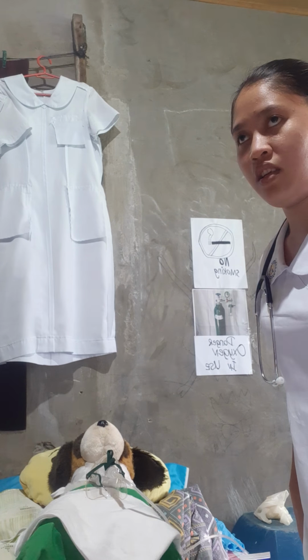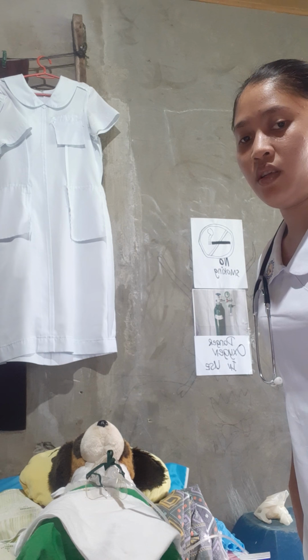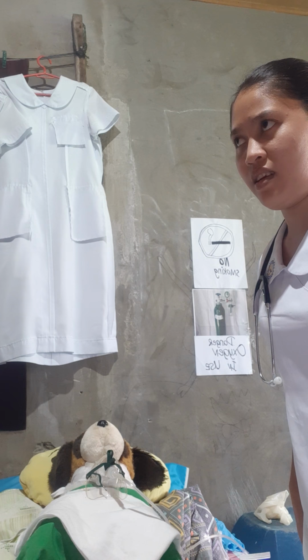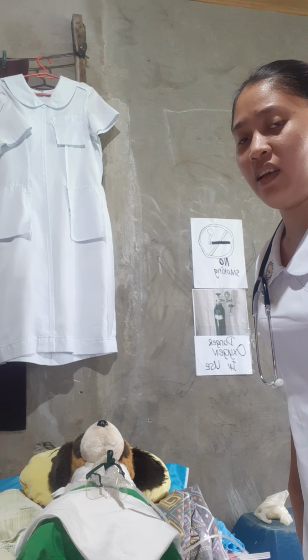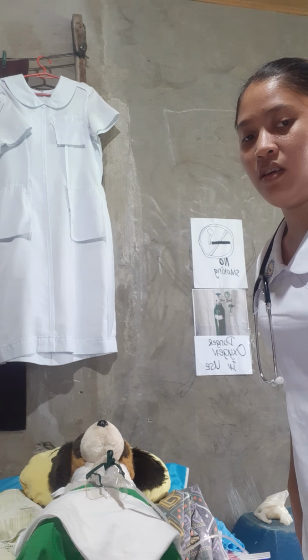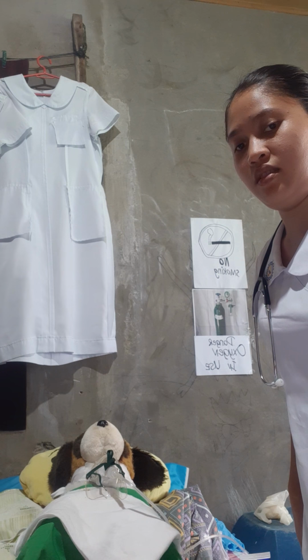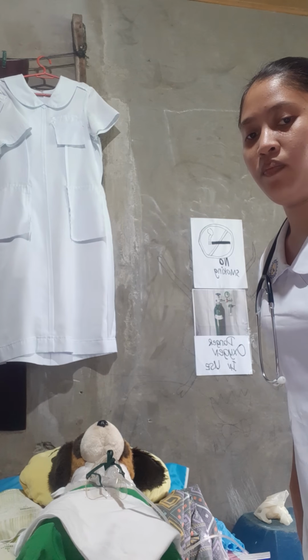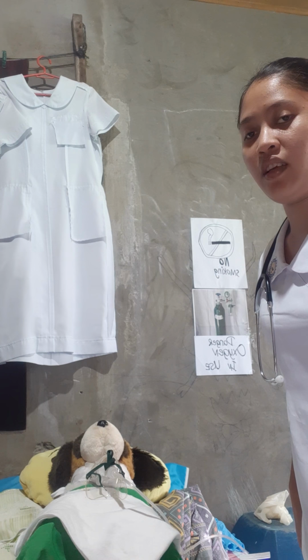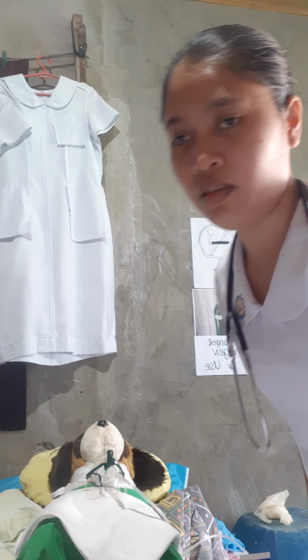Then after that, we need to report the accidental decannulation and or respiratory distress that we encounter during the procedure, and report it to the healthcare provider that is present. Okay, that's all. Thank you.